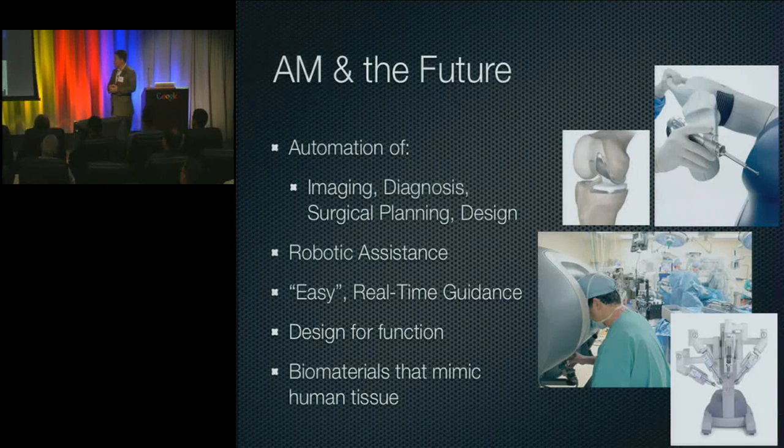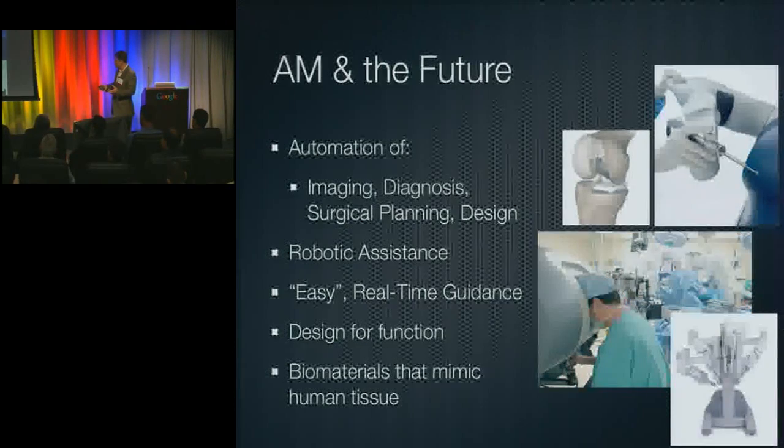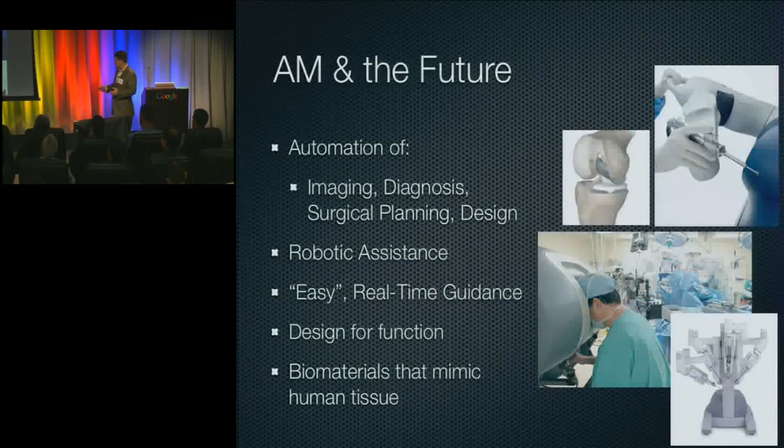So the interim step between now and full automation of surgery is actually robotic assistance. Two main technologies, one related to an actual robot. This is called the Da Vinci system. This is fairly widely publicized, but a surgeon sitting in the corner basically guiding small hands that can go in and do things in very tight spaces in the patient. So this robot sitting over here, actually working in the patient with different tools, surgeon sitting in the corner drinking a cup of coffee and guiding this thing like a video game.